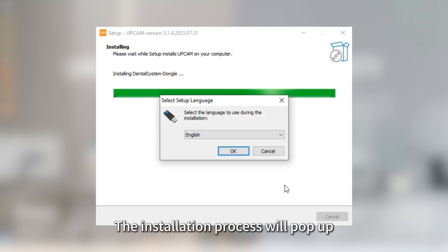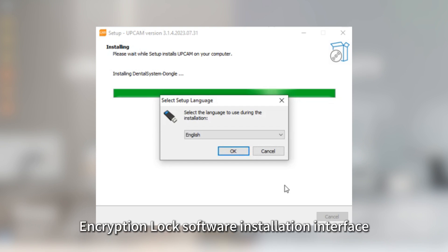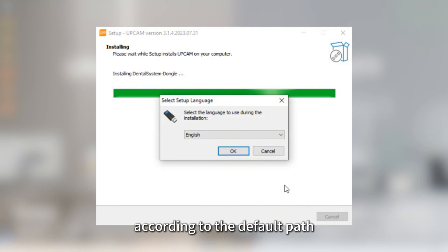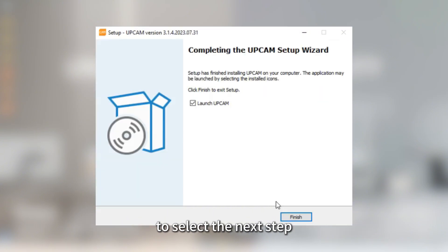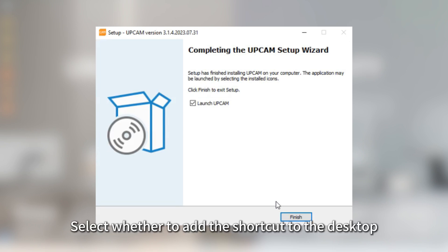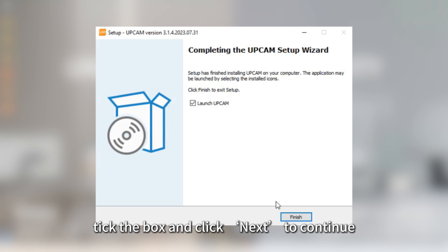Installation of Encryption Lock. The installation process will pop up the Encryption Lock Software Installation Interface — follow the default path to select the next step. Add Shortcut: select whether to add the shortcut to the desktop, tick the box and click Next to continue.